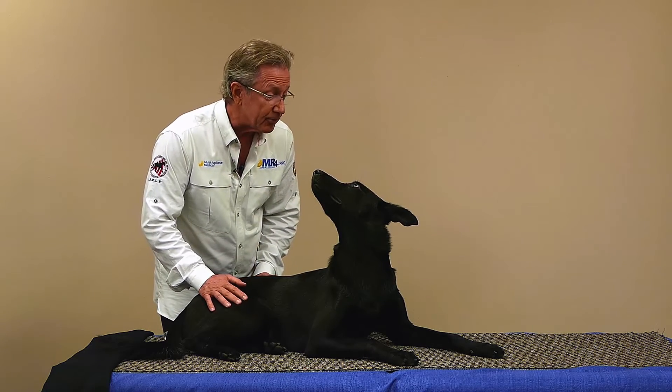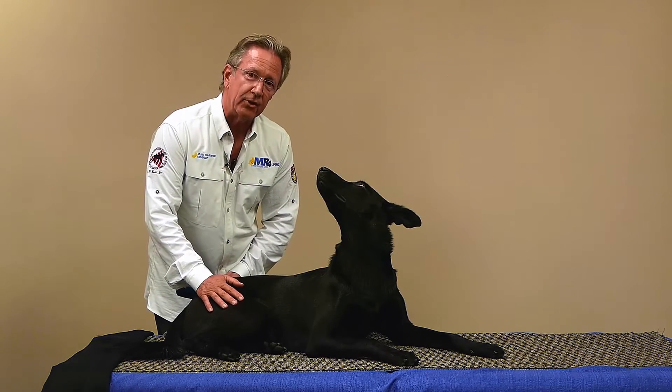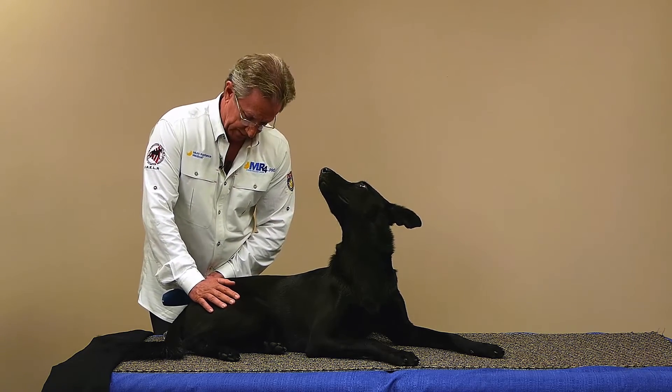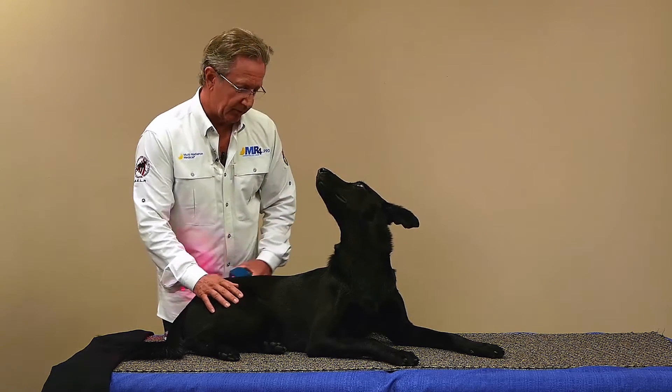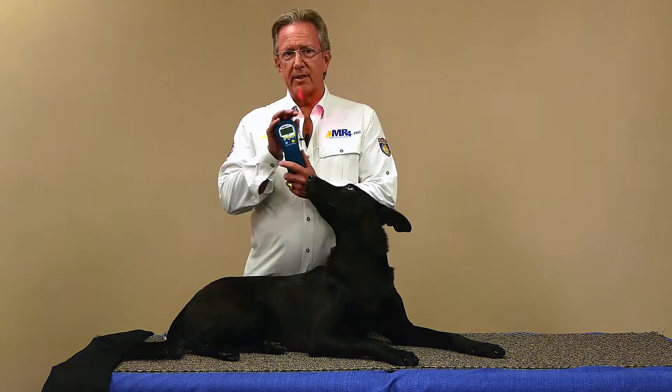You're feeling pretty good, aren't you? It's so wonderful having this communication with these animals. They really let us know that it's feeling good, and that's just such a pleasurable thing for us to know that this animal is really benefiting beautifully. So that's the unwind protocol with the laser by itself.